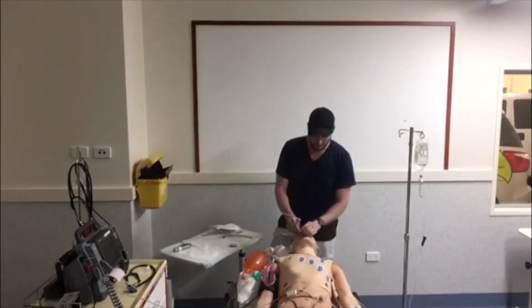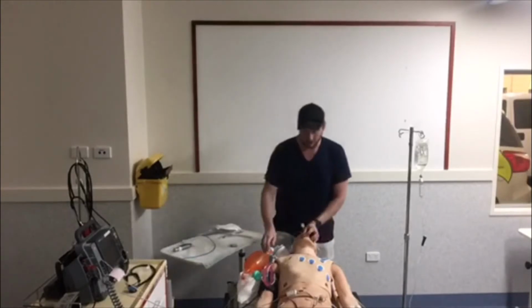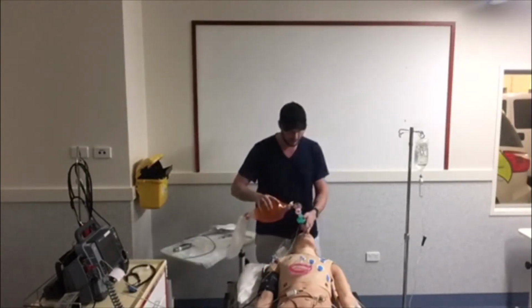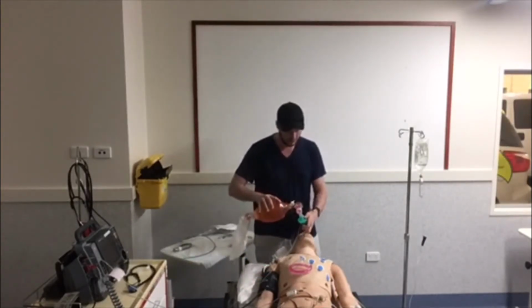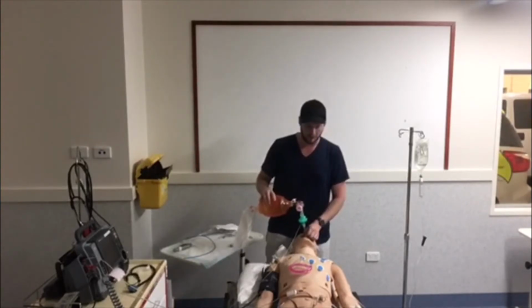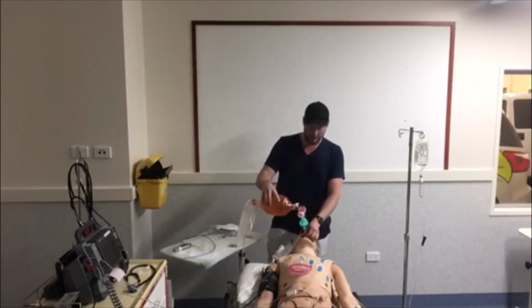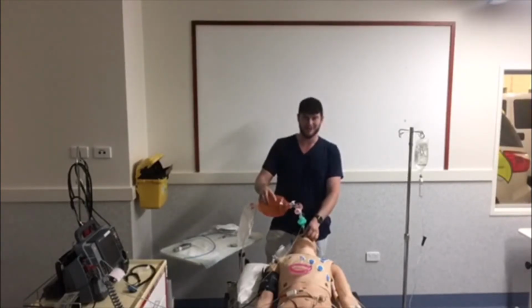Laryngoscope out, bougie out, and I'll get my airway assistant to hold my ET tube in. Need to confirm placement as well. Alright, so confirming placement, I really want to see equal rise and fall of the chest. I'll auscultate the chest, auscultate the abdomen region just to make sure it's actually in the lungs. Fogging and misting of the tube, and also gold standard end-tidal CO2 capnography is coming back on my monitor here.